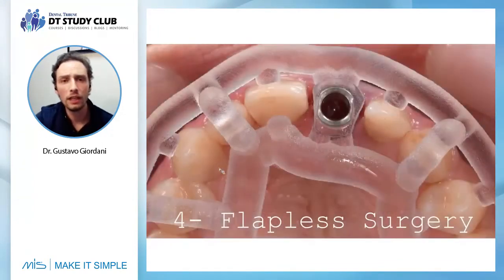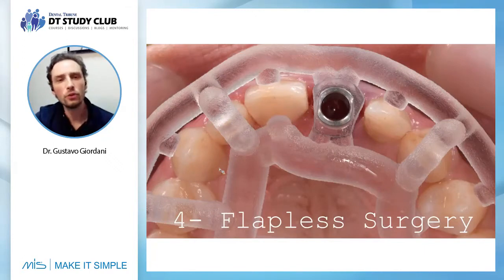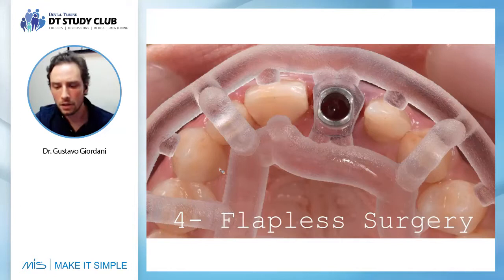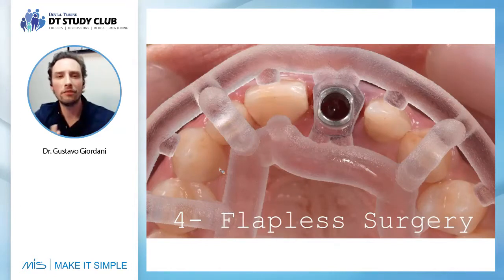Then we go to the implant placement process. And all the time, try to avoid opening flaps as much as you can. I'm not saying that when you do guided surgery, you need to be flapless all the time. Opening the flap is not about being guided or not being guided.